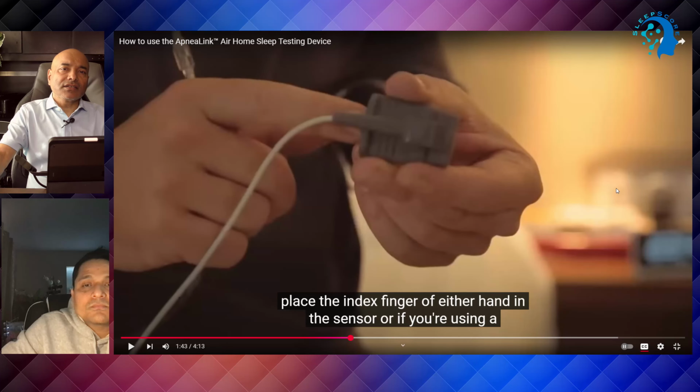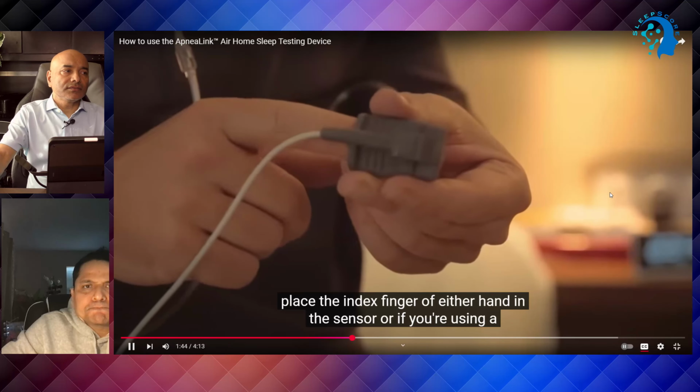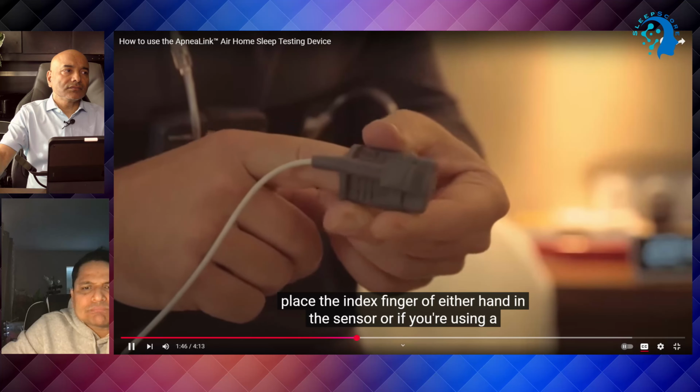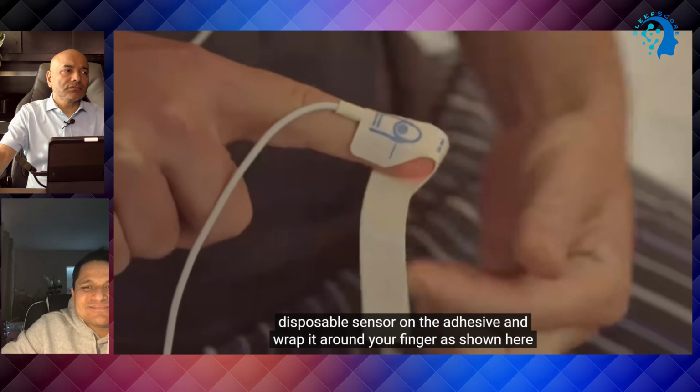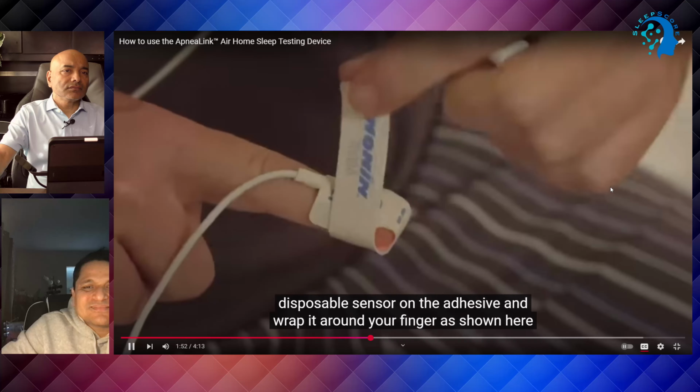Yeah, this device is called a pulse oximeter, okay? And it monitors your oxygen saturation and pulse rate. Place the index finger of either hand in the sensor, or if you're using a disposable sensor, on the adhesive and wrap it around your finger.